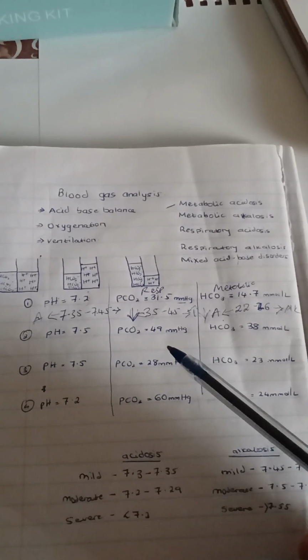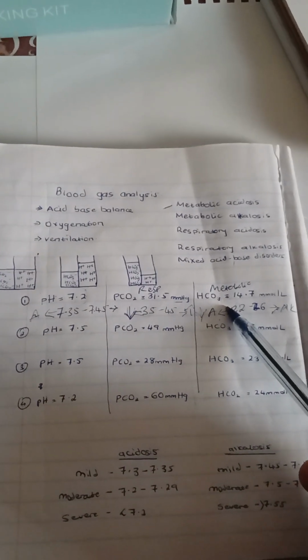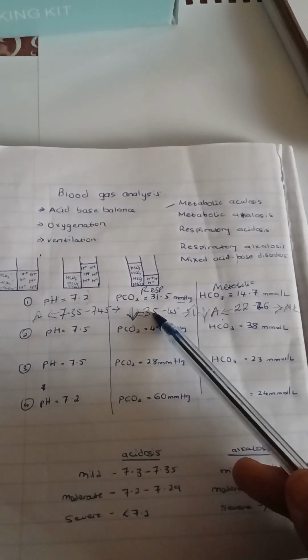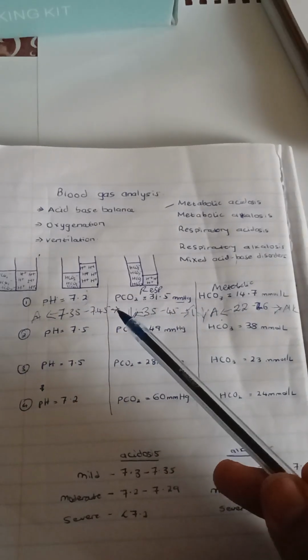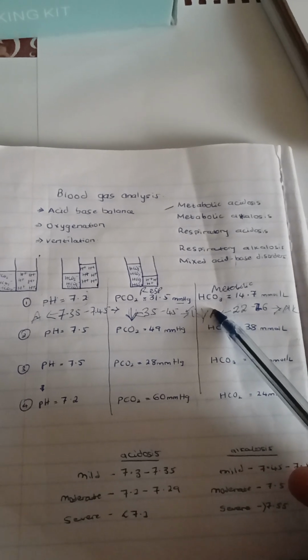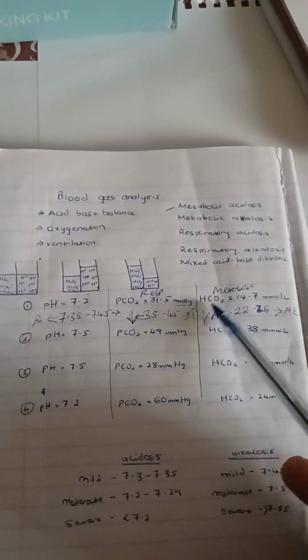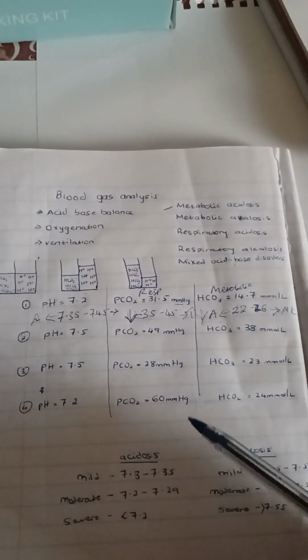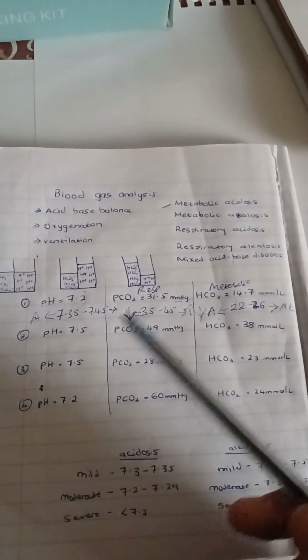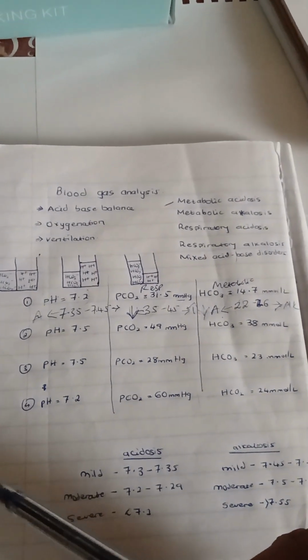Now one thing you've probably noticed is that the direction the PCO2 goes is the same direction the bicarb goes, to maintain the balance. See, both have different charges. One is an acid, one is a base. So if PCO2 goes down, bicarb has to go down to maintain the acid-base balance. And you see in all these four examples, they go down or up in the same direction. If the directions are different, that suggests something else, which we'll talk about in another video.